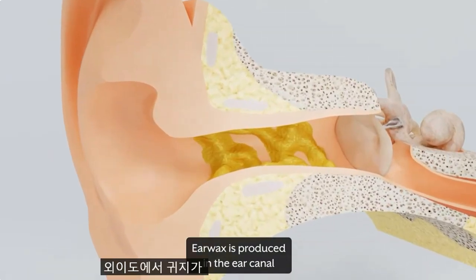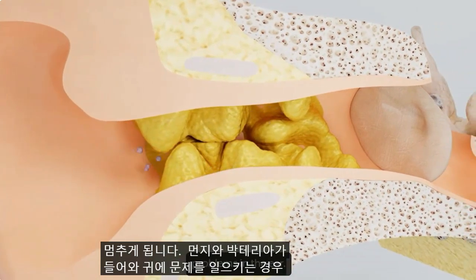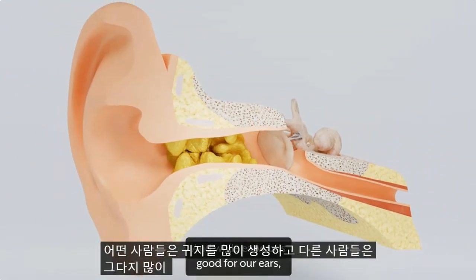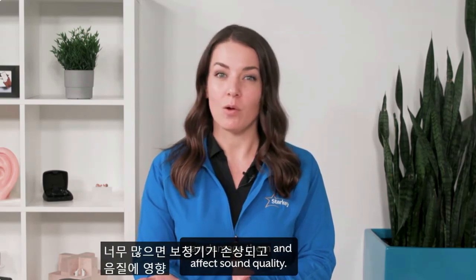Earwax is produced in the ear canal to stop dust, dirt, and bacteria from entering and causing problems in the ear. Some people produce a lot of wax, others not so much. And while earwax is good for our ears, it's tough on hearing aids, as too much of it can damage them and affect sound quality.